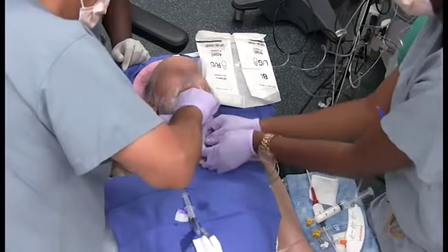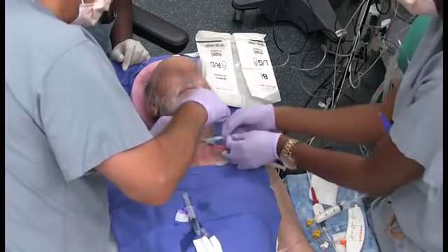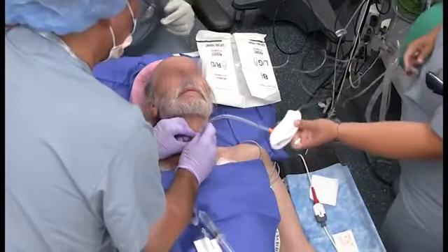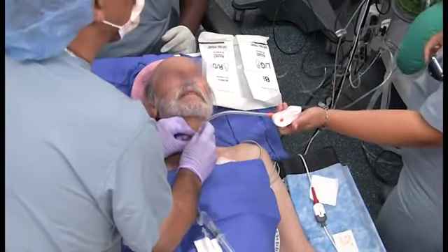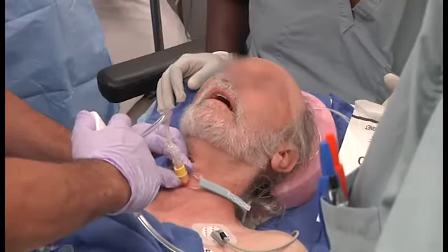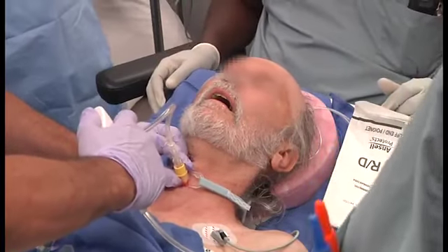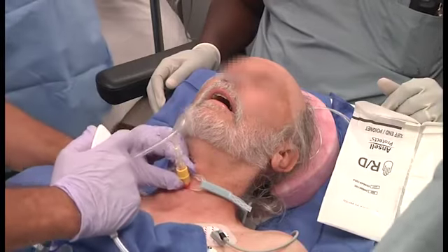After a second aspiration of air from the larynx using a saline-filled syringe, intravenous anesthesia was induced and oxygenation and ventilation commenced using a VentTrain device with expiratory ventilation assistance.